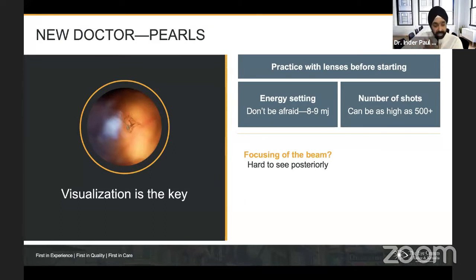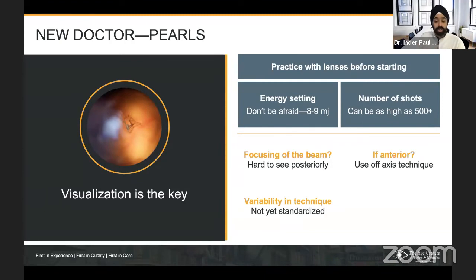And because there is a little bit of a difference between your 90 diopter lens view and the view you get with the Singh mid-vitreous lens or any of these lenses that we use. So that's a way to practice as well. And again, you're gonna have to titrate, as Dr. Biswas said. There is a learning curve. Being able to feel comfortable going oblique, coaxial, etc. Those are all little nuances, learning when to fire, how to maximize.